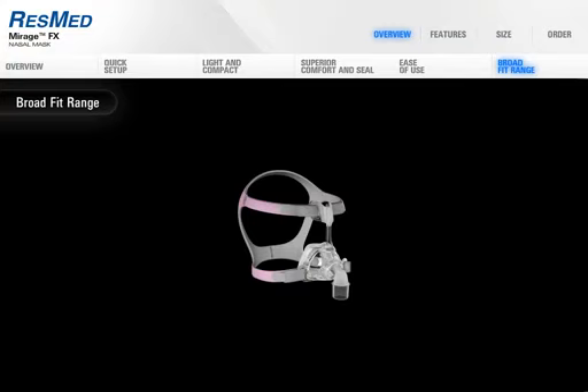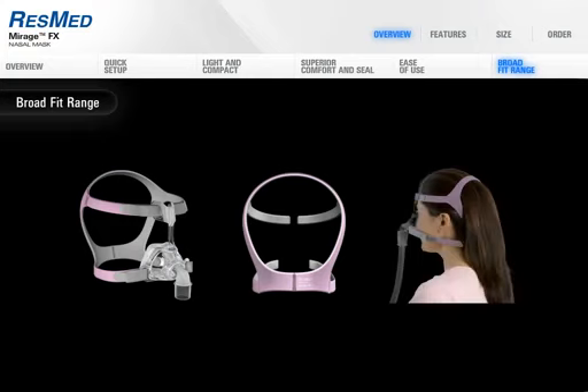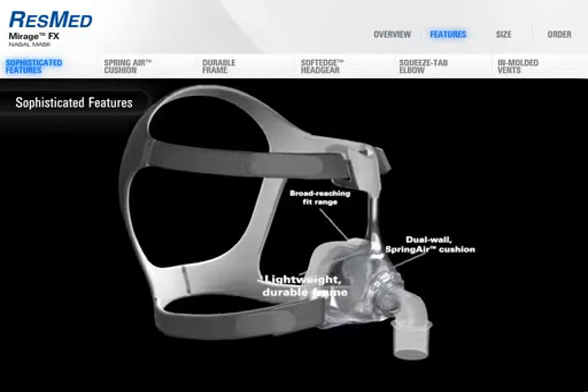Female patients may prefer Mirage FX for her. The headgear is smaller, with a snug crown strap and hair management options, and it's finished in a more feminine color scheme.